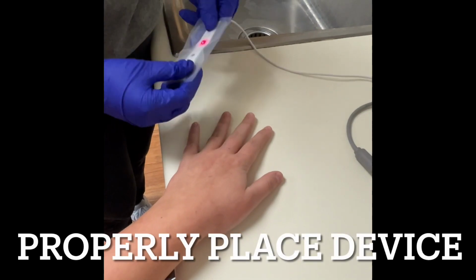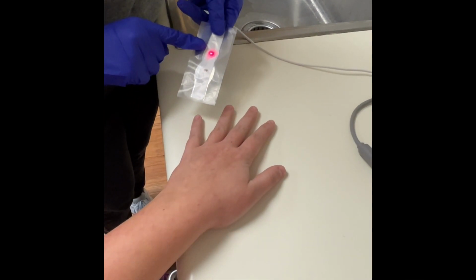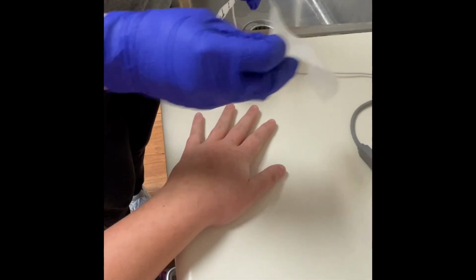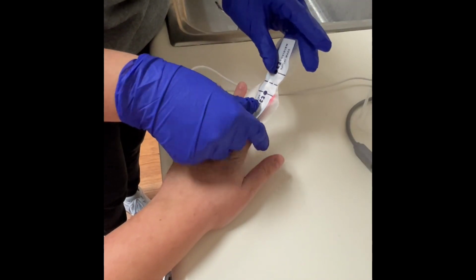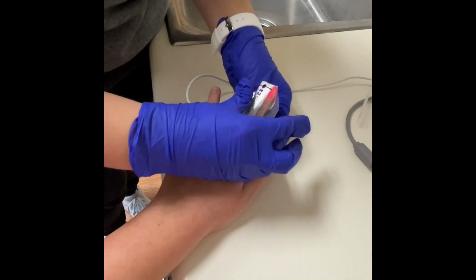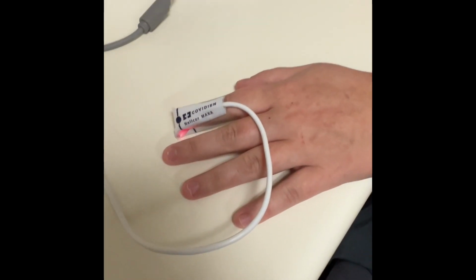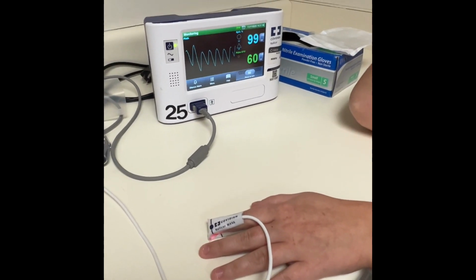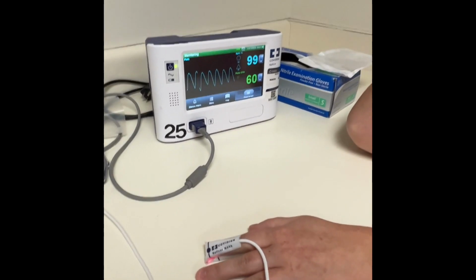Proper placement of the probe is crucial in order to get an accurate reading. As you can see, I am placing the red light on top of the fingernail and wrapping the sticky sides around the finger. This is to ensure that the probe will not move. You can also place a piece of tape on the probe wire if it happens to catch onto something. To check proper function, you can compare the heart rate that you had gotten to the pulse that is received on the pulse oximeter.